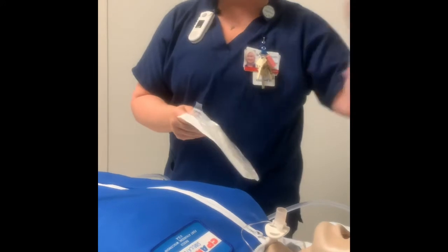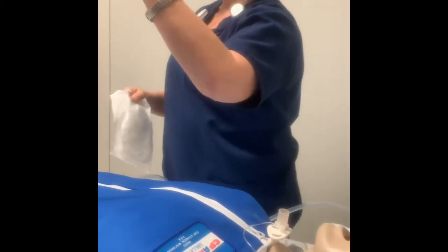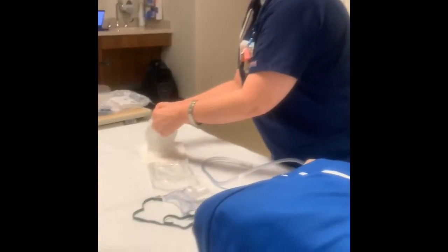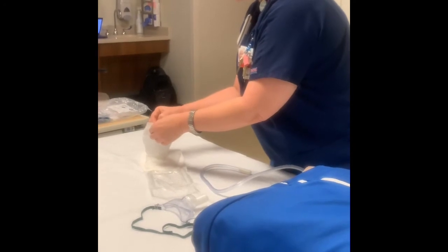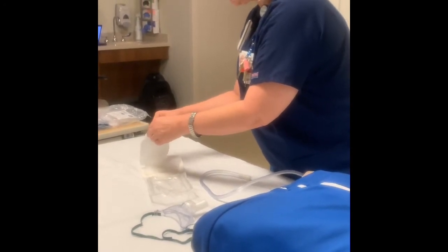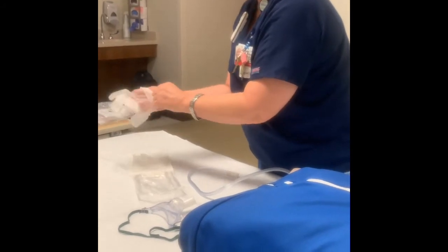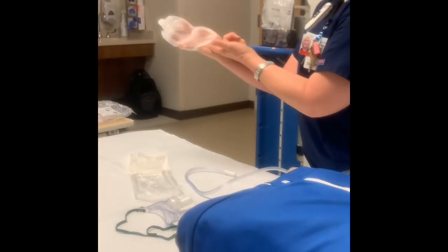So I've got it set at 150. I usually like to keep their head up at about 30 degrees when I'm suctioning them. Okay, so you're gonna open this up and this is sterile, all right? So I'm going to take one of my gloves here, and these are vinyls, which is perfect for me because I am allergic to latex gloves.